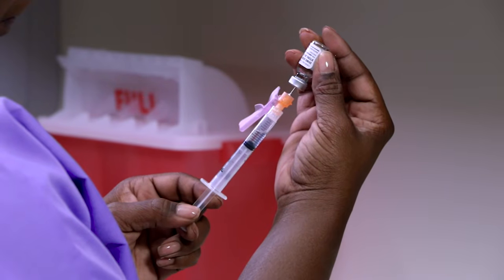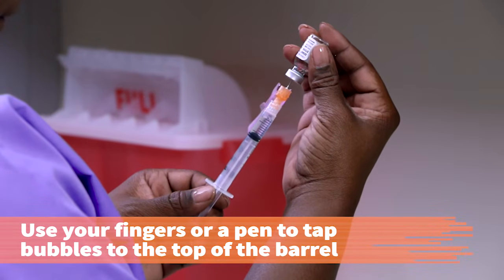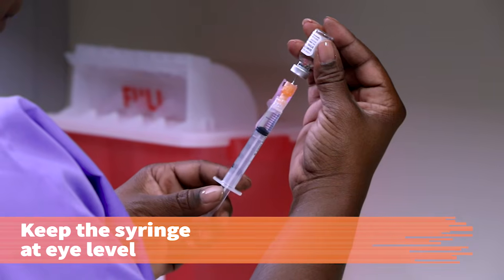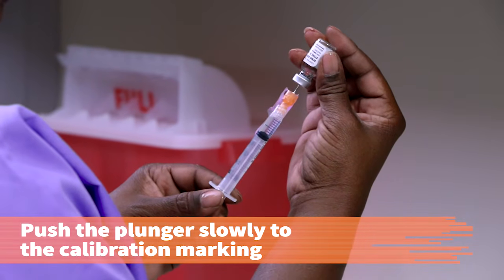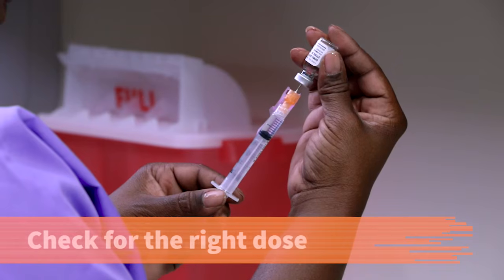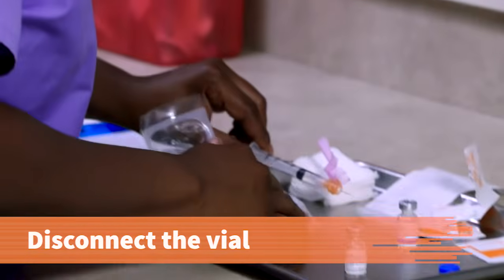Continue to hold the vial and syringe unit in a vertical position with the needle pointing upward. With your dominant hand, use either your fingers or a pen to tap the bubbles to the top of the barrel. Keep the syringe at eye level. Once all the air bubbles are at the top, push the plunger slowly to the correct calibration marking for the ordered dose. Double check that no air bubbles are in the syringe and that the right dose was measured. If everything is correct, disconnect the vial from the syringe and needle unit.